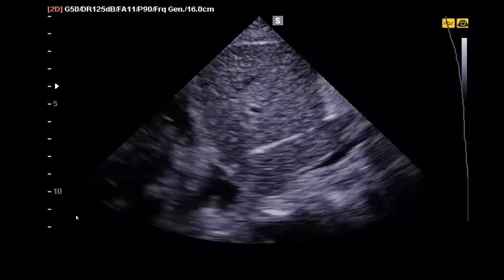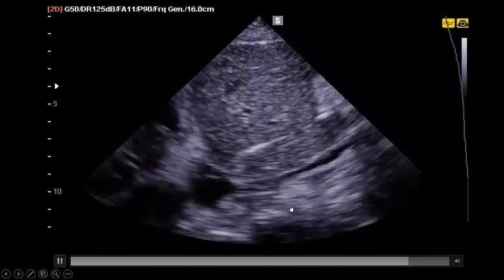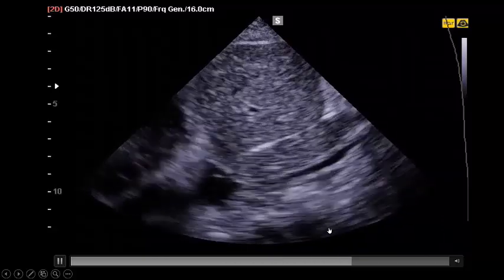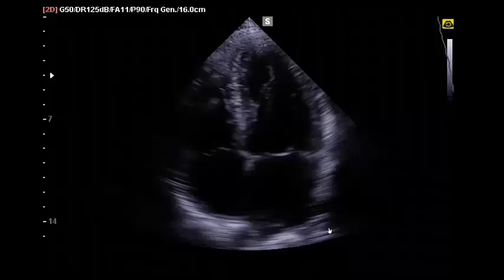First, the inferior vena cava. As all of you know now, I usually start with the inferior vena cava in advanced critical care ultrasound. The inferior vena cava of our patient is narrow, totally collapsing, denoting normal right side pressures. After that, we go to the heart.